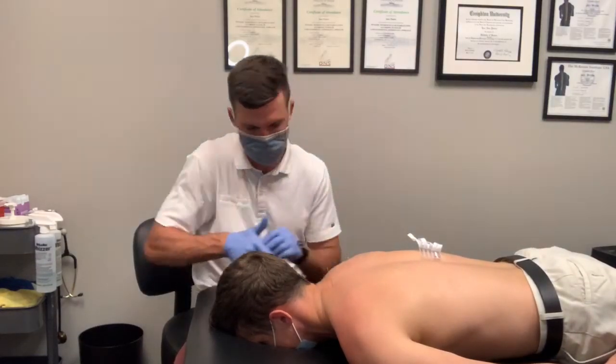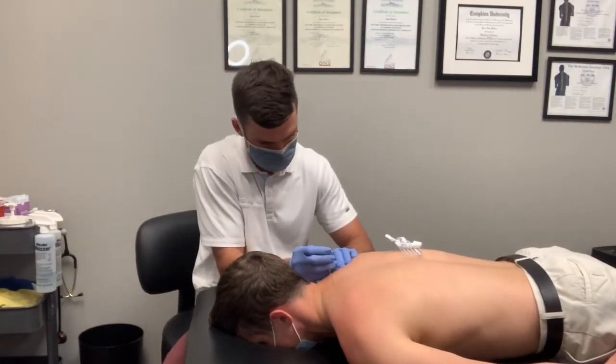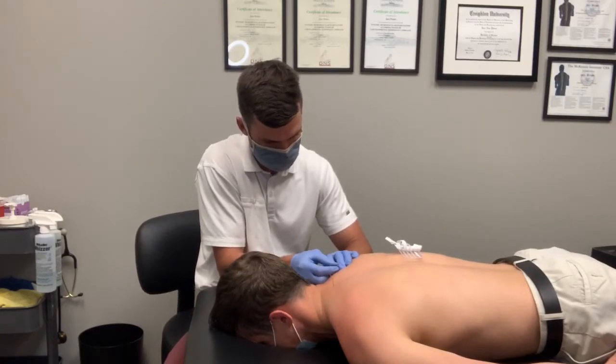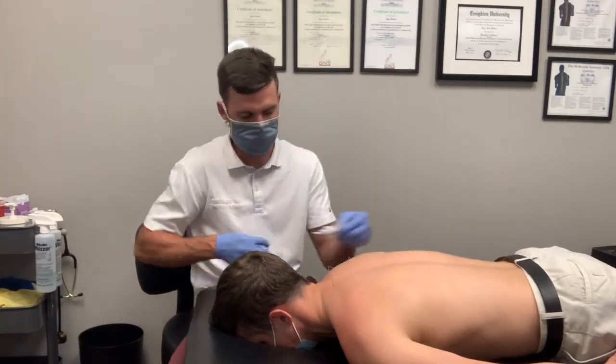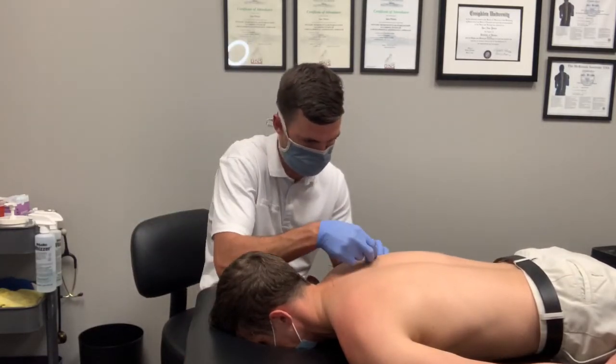Functional dry needling is safe and effective for multiple types of musculoskeletal conditions. Treatment involves placing a thin monofilament needle in an area of localized muscular dysfunction, allowing for relaxation and symptom improvement. Seen in this video is dry needling with intramuscular stimulation.